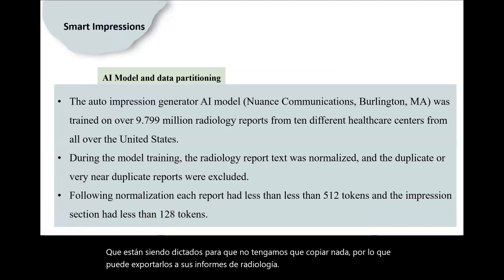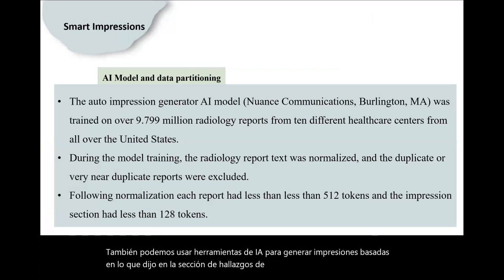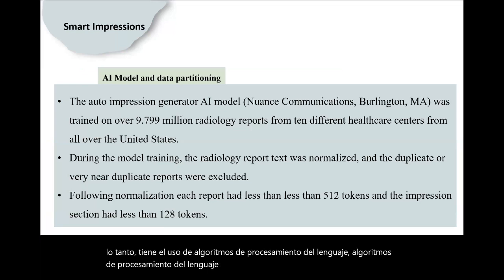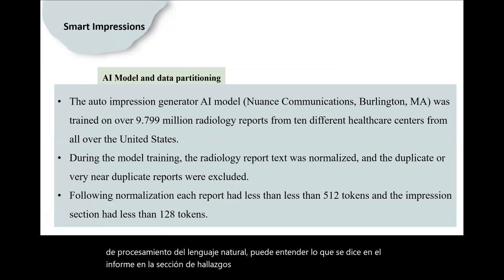Similarly, we can also use AI tools to generate an impression based on what you said in the findings section of the reports. This is still in a development phase, but the initial results are very promising. Using natural language processing algorithms, it can understand what is said in the findings section of the report, and it can generate a succinct impression, thereby saving time. And it also minimizes the risk of not mentioning something, which is important in the impression.